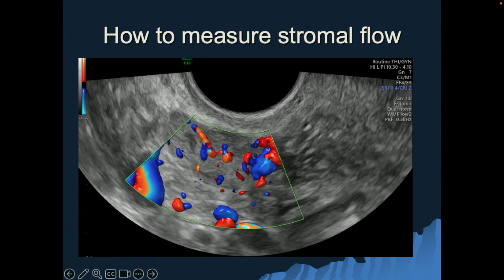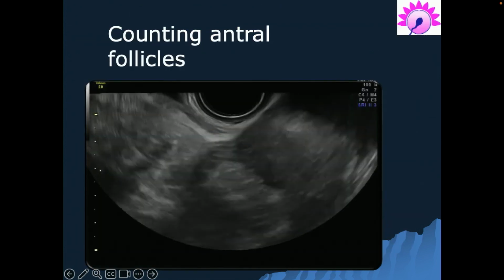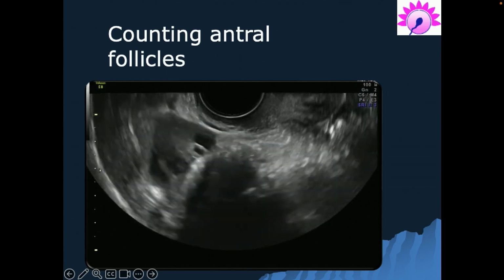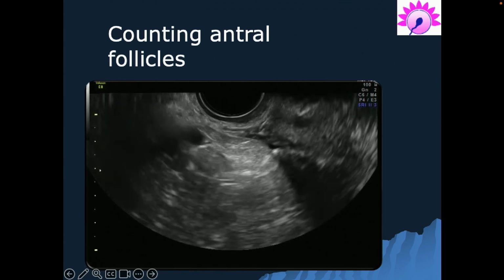As we discussed, it is also the reserve of the ovary. We know that we want to measure the reserve of the ovary. I did tell you that we will count the antral follicles and we will measure the ovarian volume. The antral follicles we have already done when we were doing the baseline scan. You locate the ovary, scroll the probe so that you are not seeing the ovary, and then come back in the same direction, eyeball and count the number of follicles.